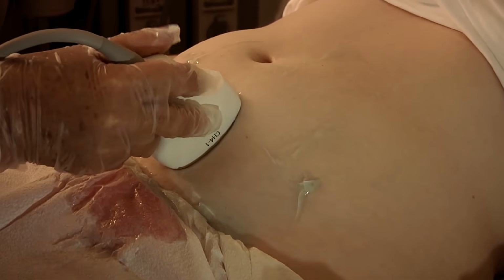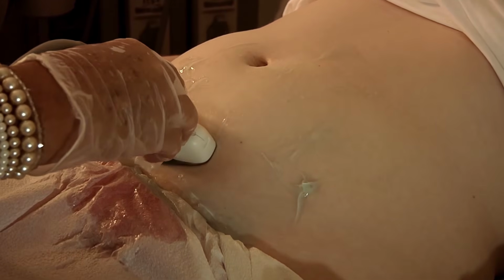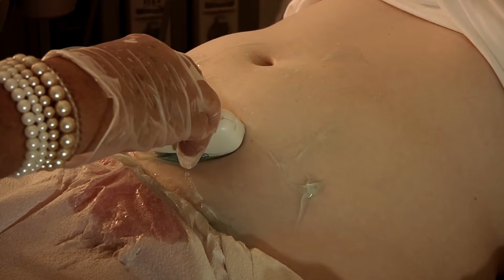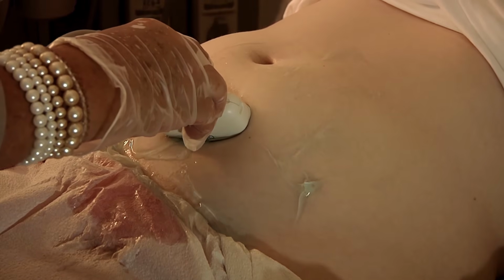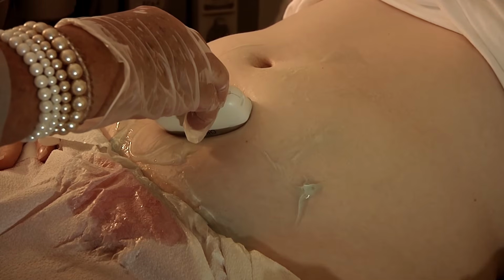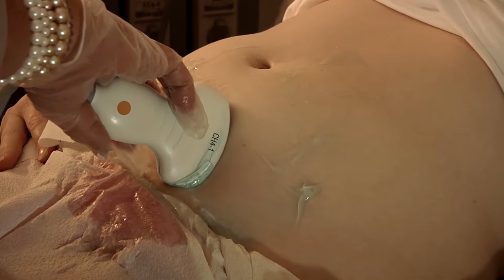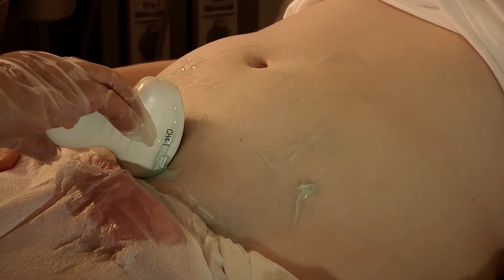So here you got part of baby. Let's just turn it till we stretch them out. Okay. Now if you look at my transducer, I'm like at 8 o'clock. That's okay. I just can't go this way completely around, otherwise I'm scanning backwards.